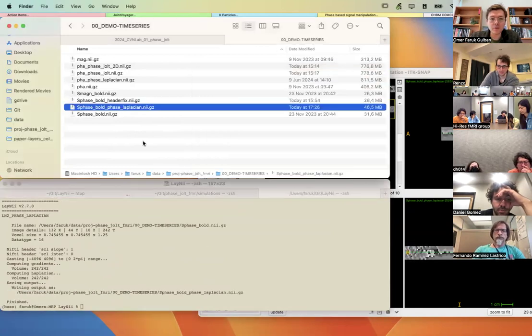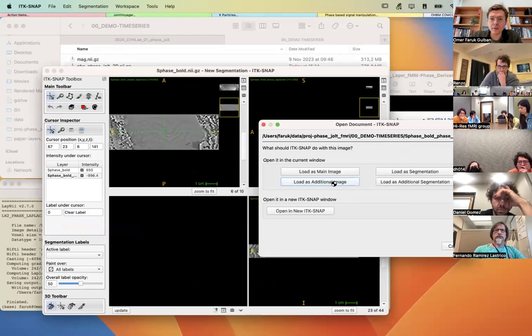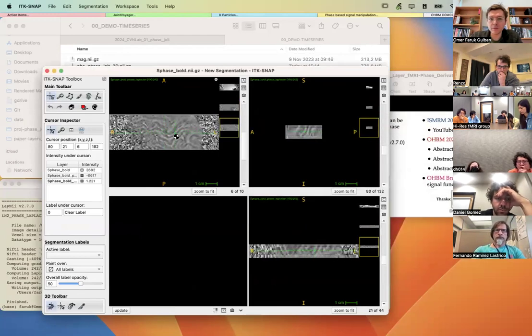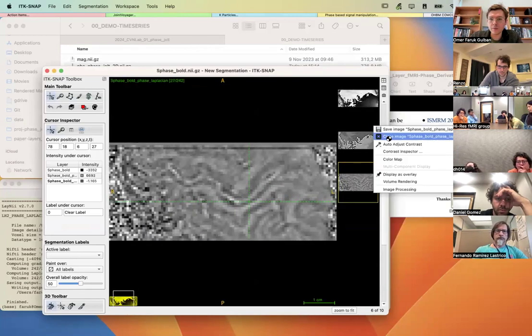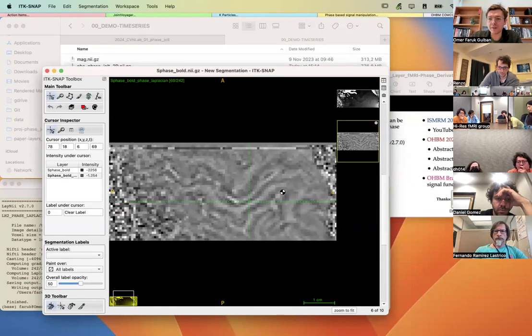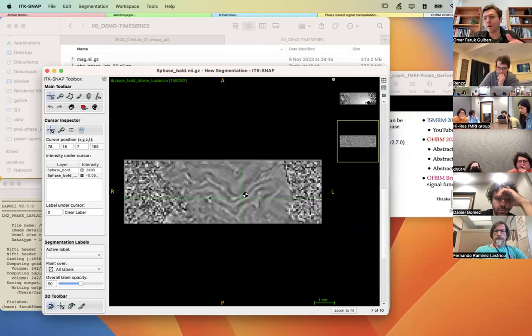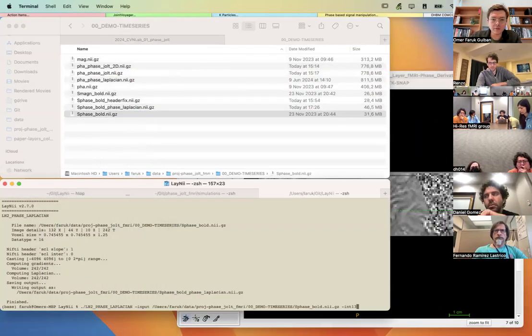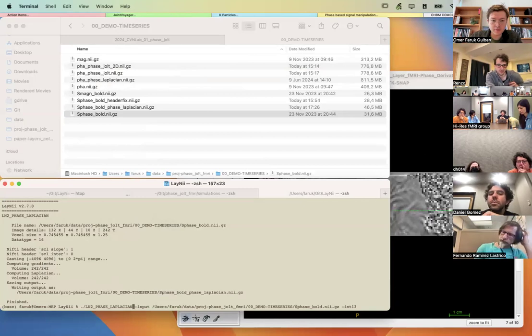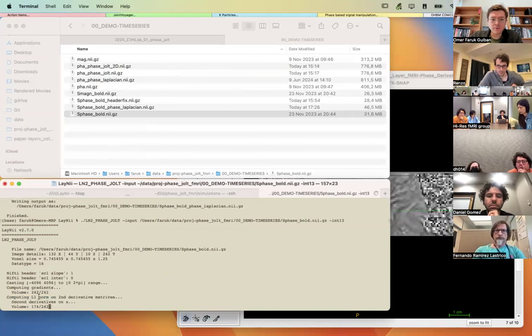And once you do that, it will compute correctly the circular difference, the second spatial derivative, and give you the following time series. And hopefully you can see that this is much more homogeneous, and in a way easier to understand for us humans. And here you can just take this data and apply the rest of your processing pipeline, like motion correct, do this, that, whatever. So to show you the phase jolt, you do the same, it computes.